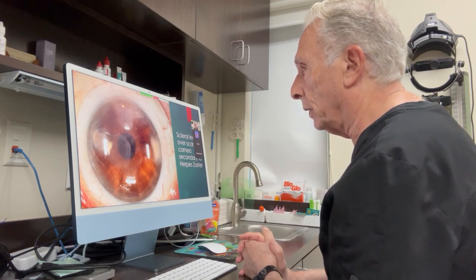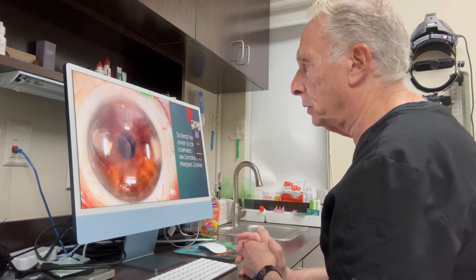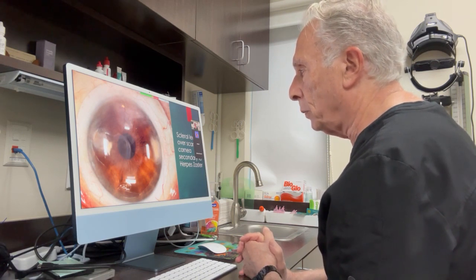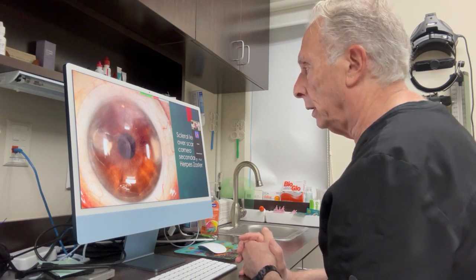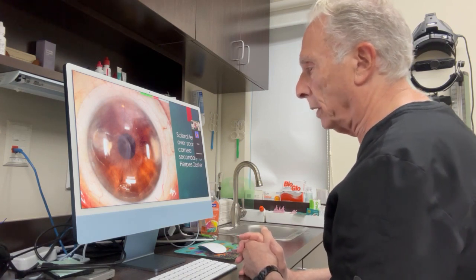We fit the eye with a scleral lens. This patient with the lens has around 20/80 vision, which is good enough for her. She lives alone, by herself, and if she needed a transplant, there'd be nobody to take her to the doctor or to the hospital. So she's wearing this lens. She has an aide that helps her insert the lens and remove the lens.